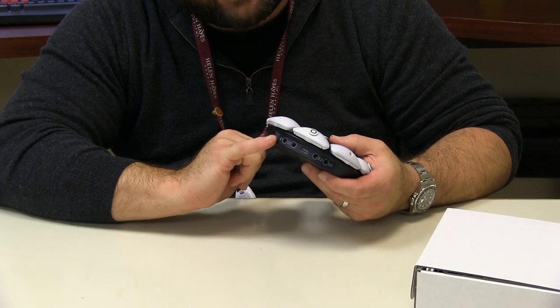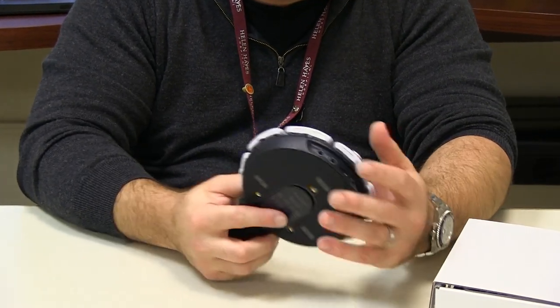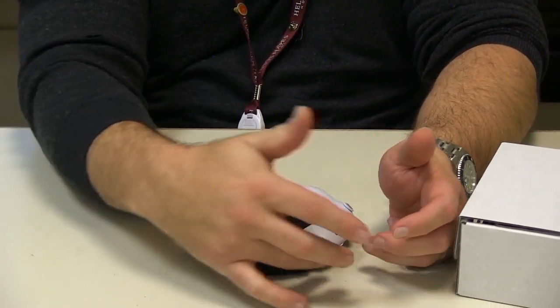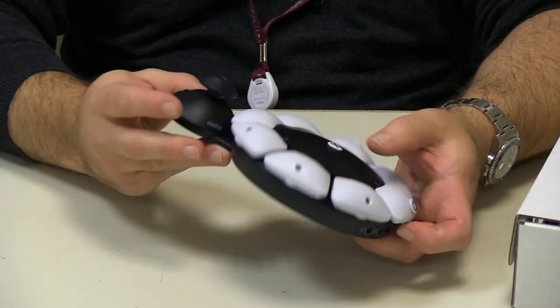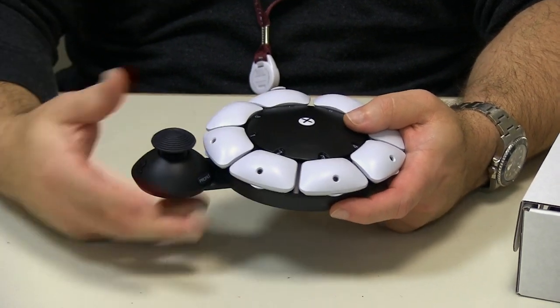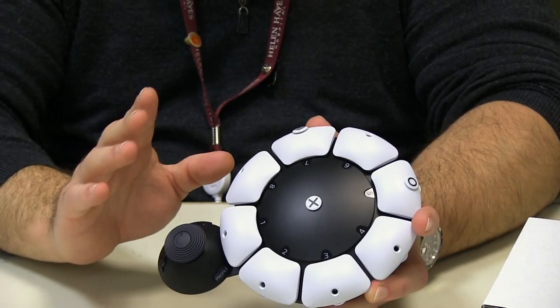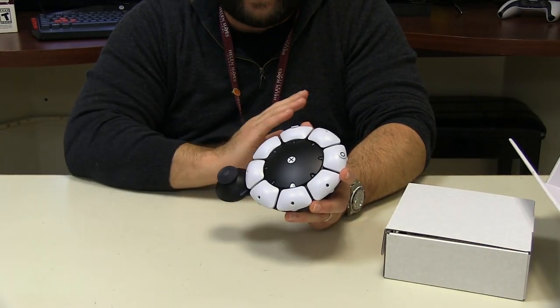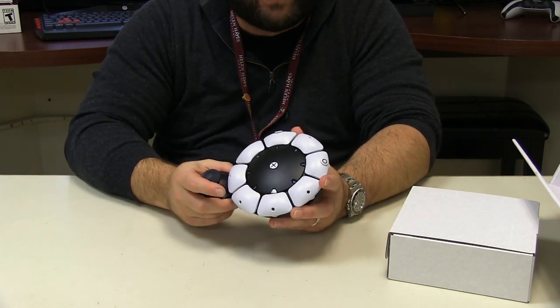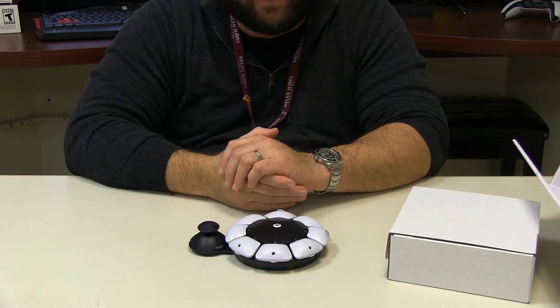The other thing we have here are four inputs — these are your E1s through 4s. This allows things like a buddy button to be plugged in and programmed. So it seems like you can get 8, 9, 10, 11, 12, 13 different button presses, and you still have your PlayStation button and your clicks. There's a lot of function built into just one of these. You can have two of these at the same time, so you can have all sorts of things programmed and create all sorts of different combinations.